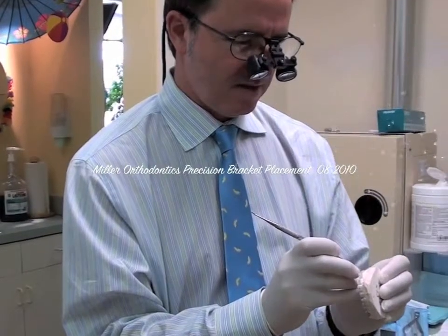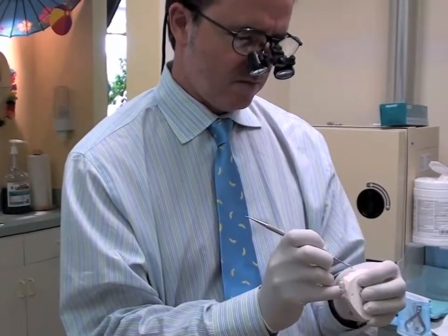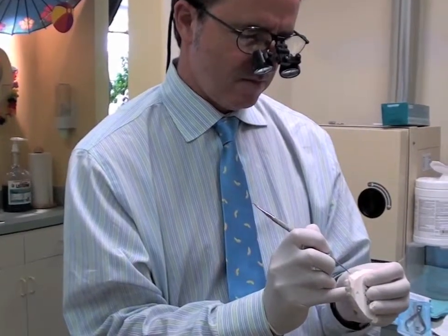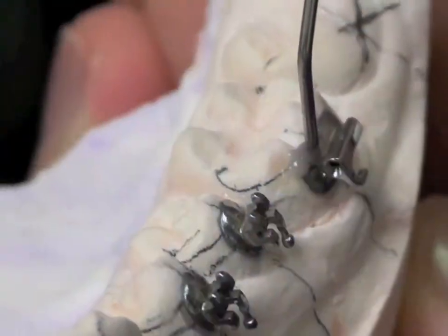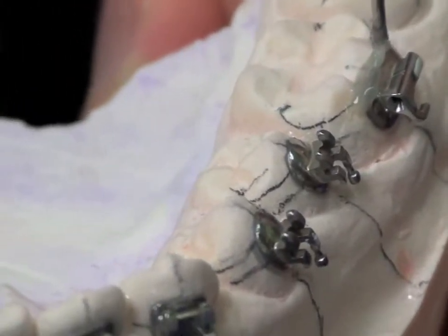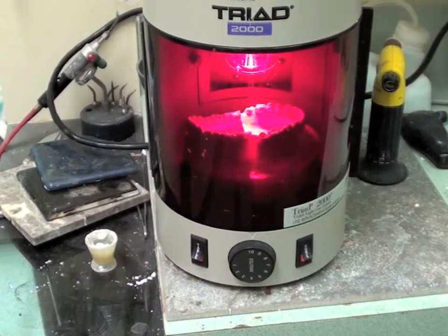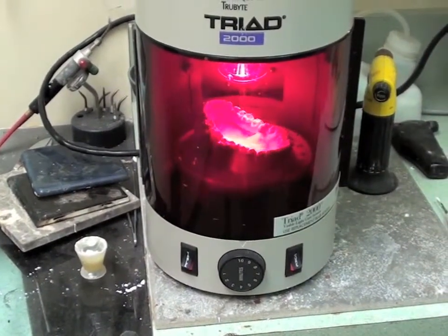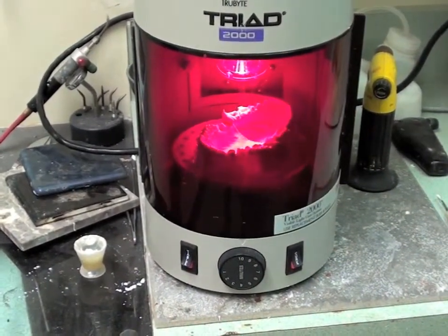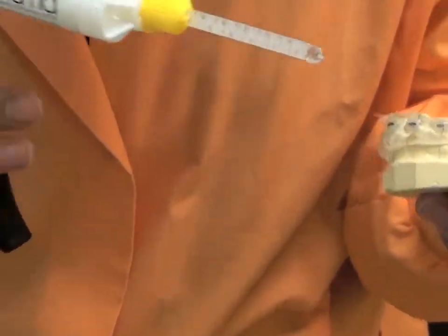Brackets are placed on a marked model port of resin reinforced stone painted with a separator solution. We use AVEX MX Micro Milled Brackets from Opal Orthodontics, which have the most accurate slot dimension. We create the custom base using Opal Bond MV and cure in a triad machine. We then follow a technique developed by Dr. Duncan Higgins.